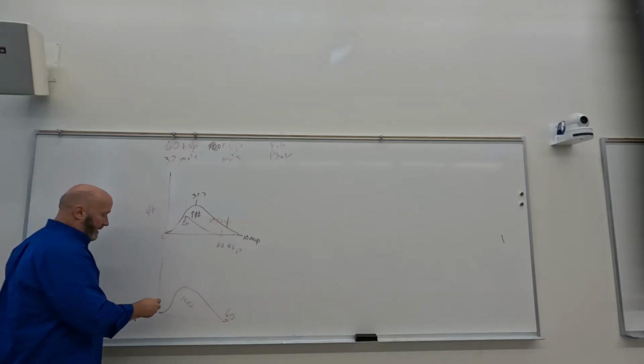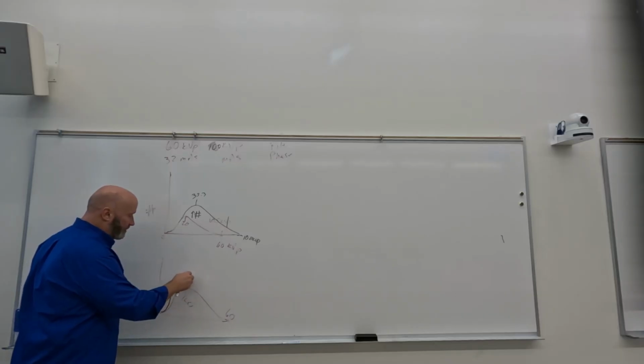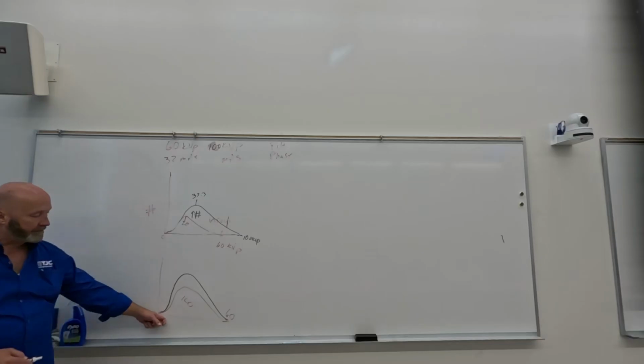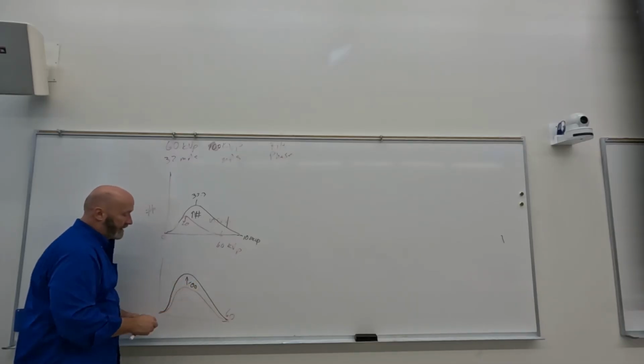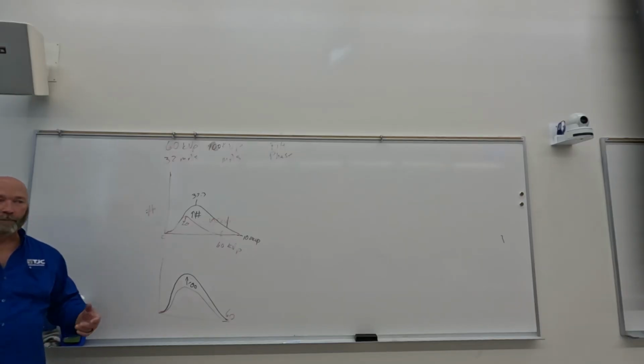So when we increase our mAs, the only thing that happens is we get a bigger bubble. Peak energy remains the same, the minimum energy remains the same, and all that we're going to get is an increase in numbers. So this was the 32, this is the 100 mAs, we get an increase in numbers. It's 1 for 1.